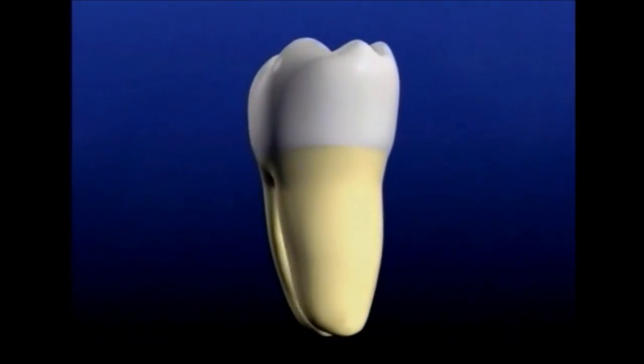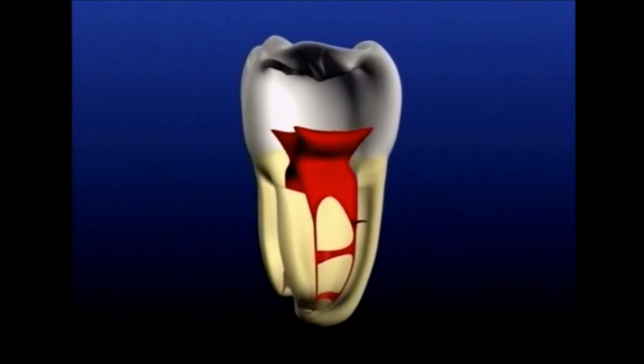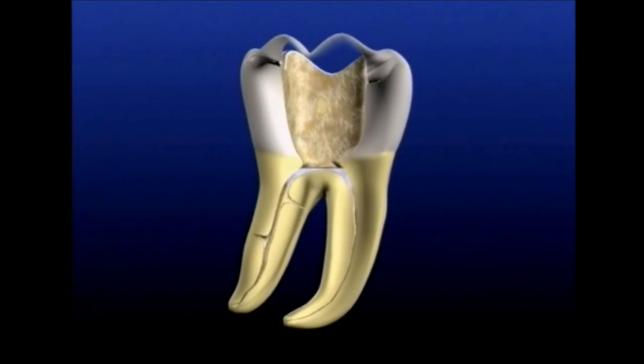When endodontic treatment is properly performed, there is enormous potential for success. To maximize success, it is wise to appreciate root concavities, root curvatures, and root canal systems. Access cavities involve removing the pulpal roof. Once that's performed, we fill the pulp chamber brim full with the appropriate irrigant.